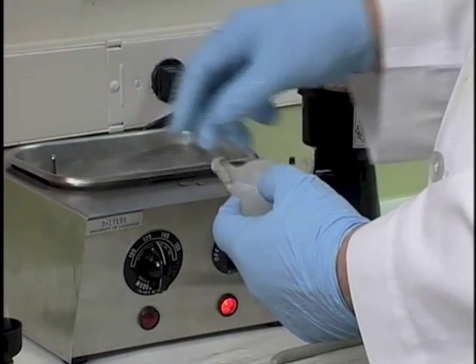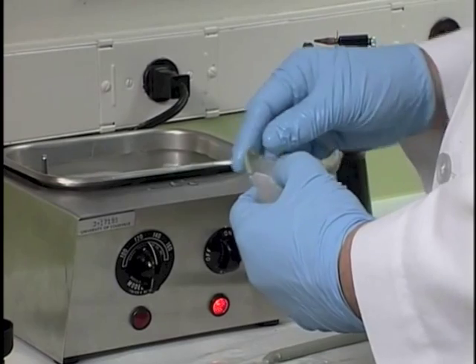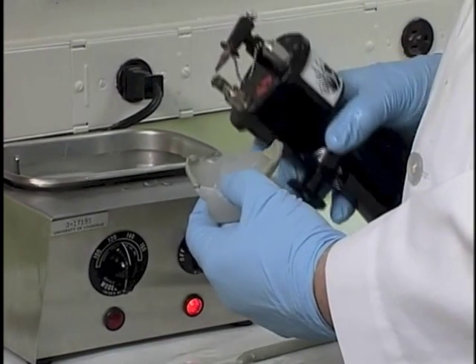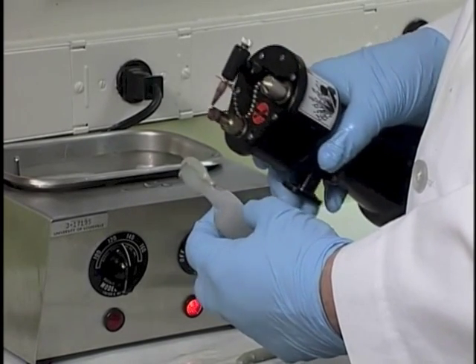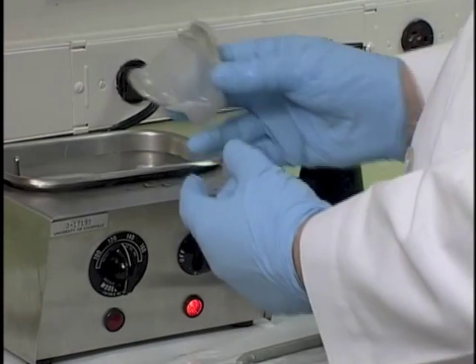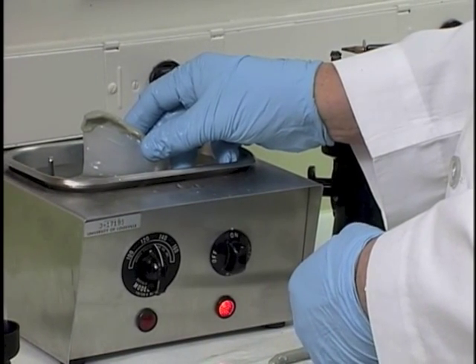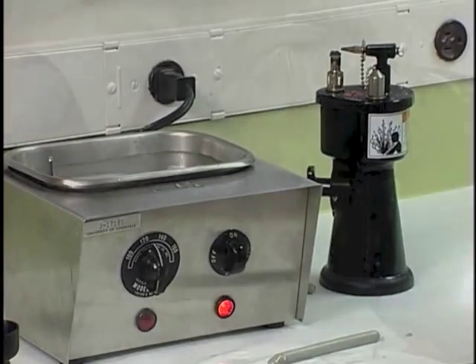So we wet our fingers after the compound's been applied, and we build it up onto the periphery like so. Then we take our torch and we superheat the compound to make sure that it is very, very soft. Once the compound is superheated and it's very, very soft, then we give it that 3 to 5 second temper.